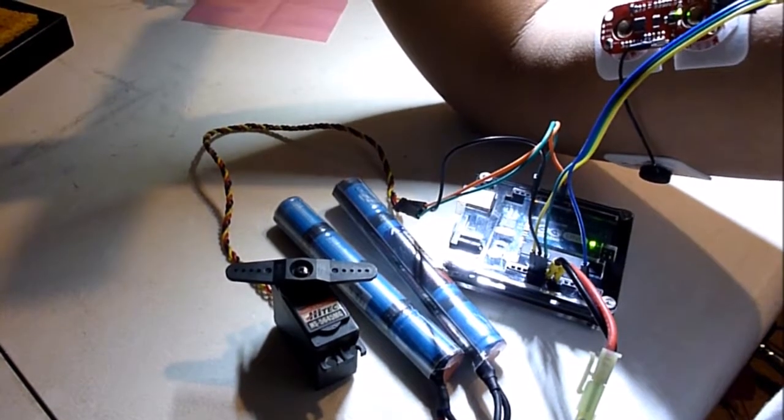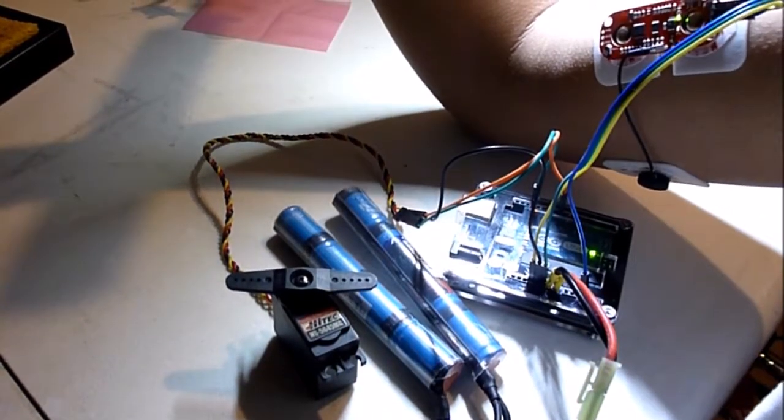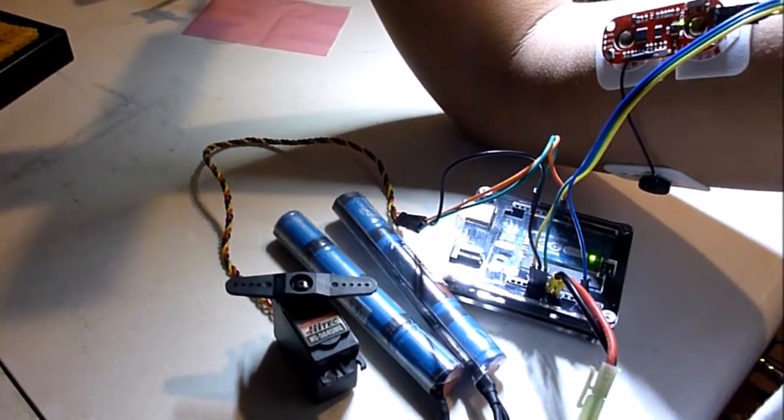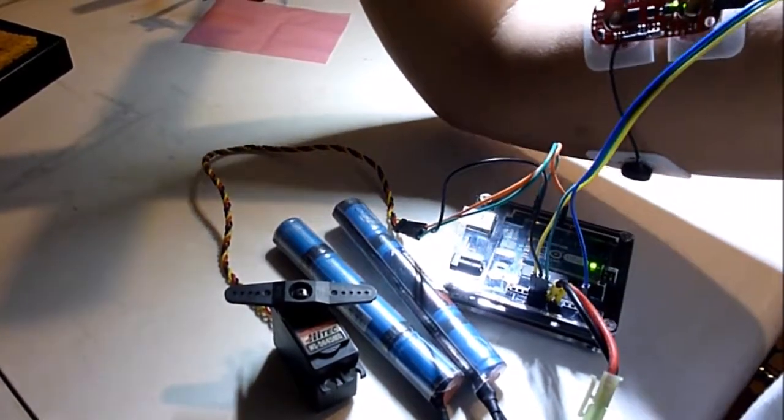Hello, today I'm going to teach you how to control the servo using the Myoware sensor by Advancer Technologies.